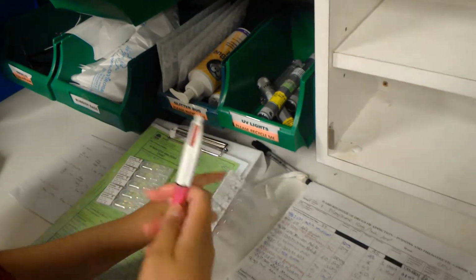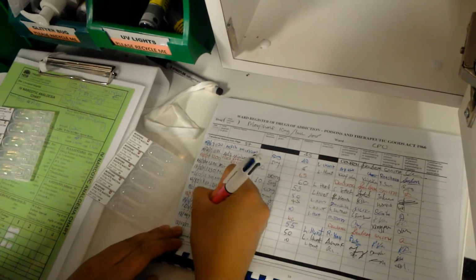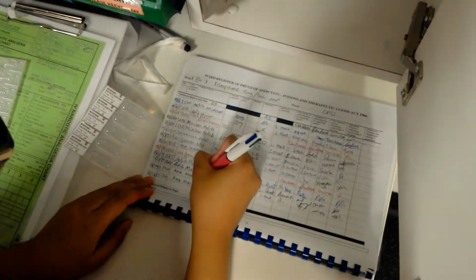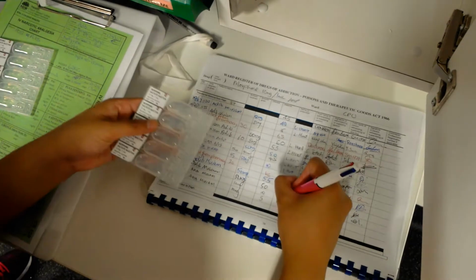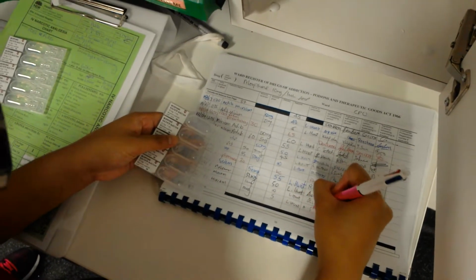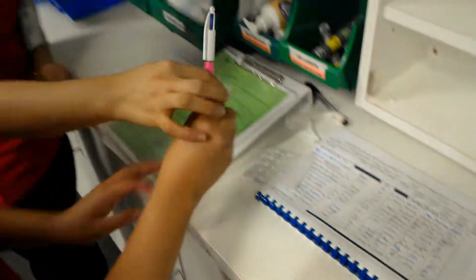So when I complete this form, I know there's just 5 left. This is what I'm returning. Prescriber is Dr. Hunt. And second nurse.